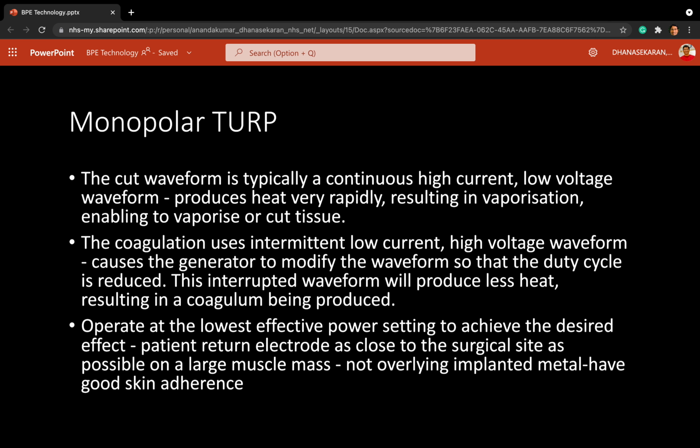Okay, so let us assume this patient in your workup is found to have voiding symptoms due to benign prostatic enlargement. What type of surgeries are you going to explain to him? He has already tried alpha blockers and 5 alpha reductase inhibitors. He's not happy with that because of his side effects. And can I ask what his prostate volume is? Say 80 cc. 80. Okay.